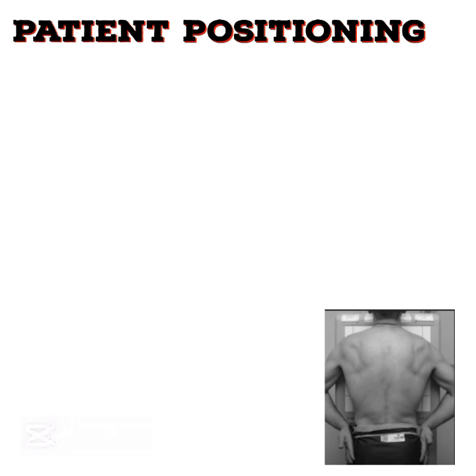The first thing under patient positioning is that the patient will be in an erect position facing the image receptor. The patient will stand upright or will sit erect depending on the condition of the patient. Some patients that can't stand will sit and they will be facing the image receptor.